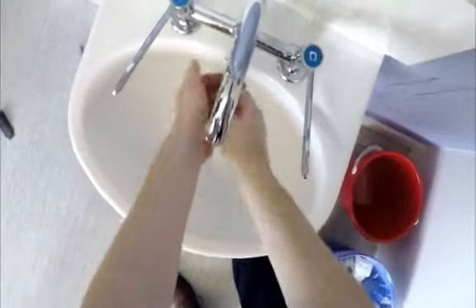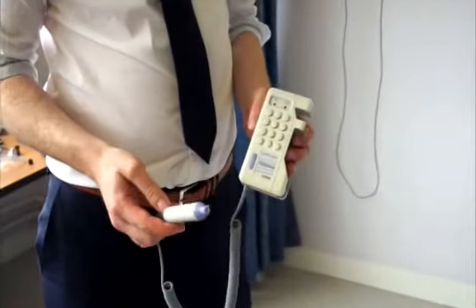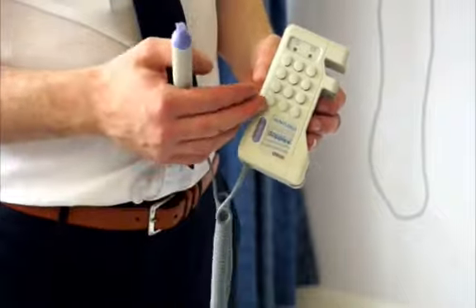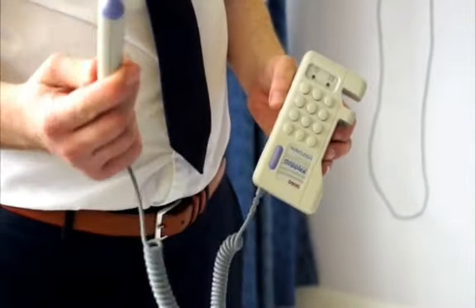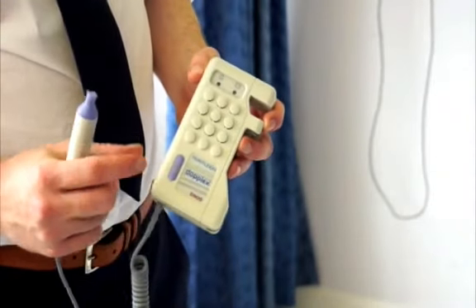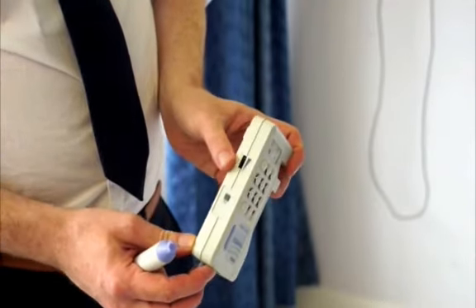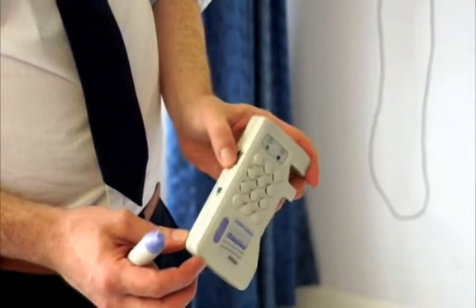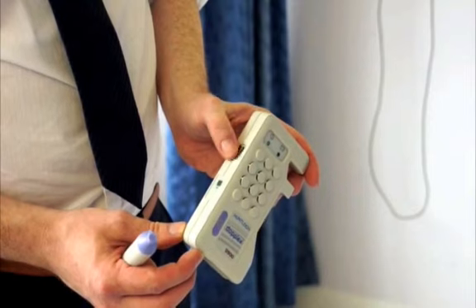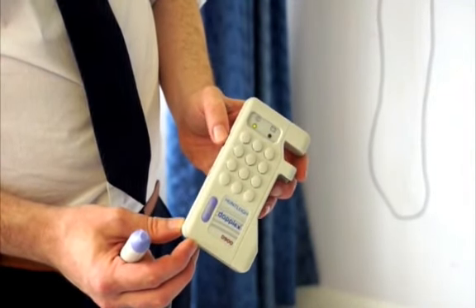Firstly, let's take a look at the Doppler box itself. This is the handheld Doppler machine. It consists of a box that creates the ultrasound transmission into a sound that we can hear, and then a probe that goes on the artery. There are two ways to turn them on depending on the unit you've got. This one has a button on the front that turns it on. On some of them, the on switch is actually part of the volume switch. So now gradually turning up the volume to a level that's going to allow me to hear the signal in the vessel.